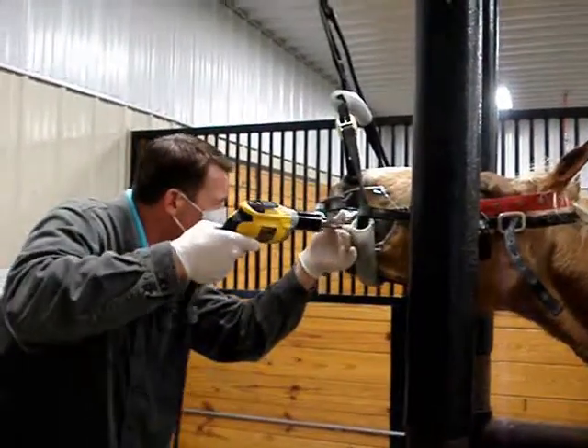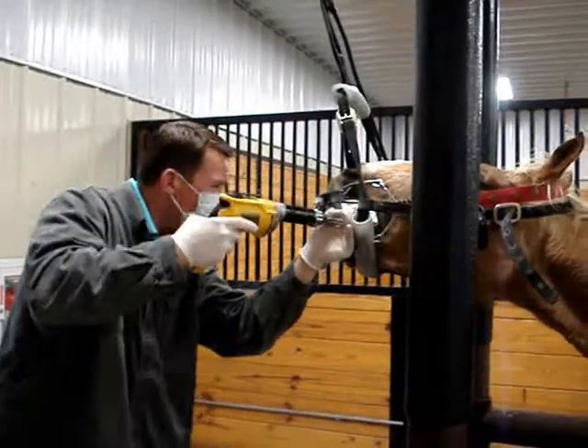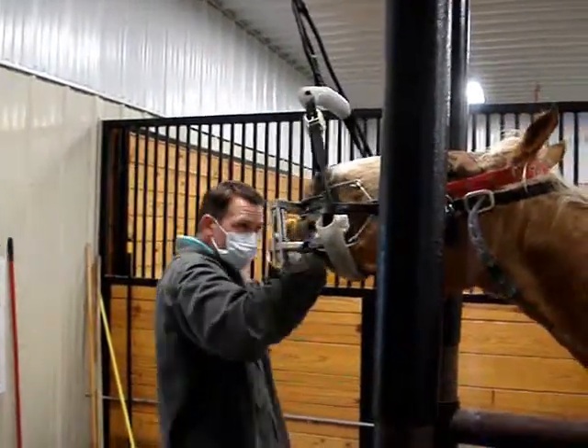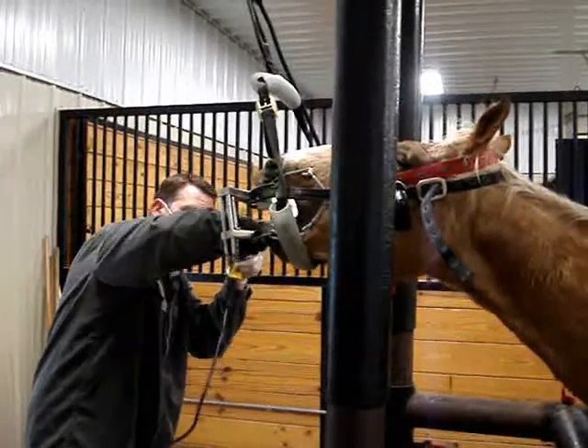We use it to first remove all sharp points, which generally occur on the cheek sides of the upper teeth and the tongue side of the lower teeth. This occurs normally on all horses due to their side-to-side chewing action, coupled with lifting a part of the teeth as the mouth reopens.